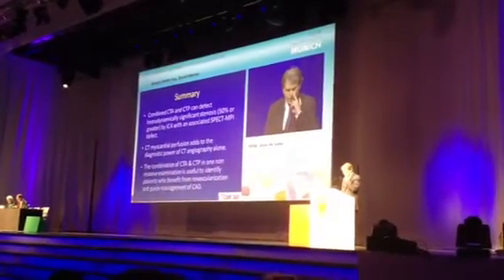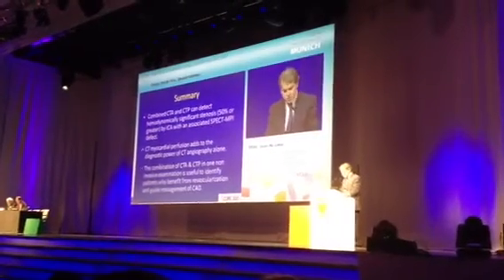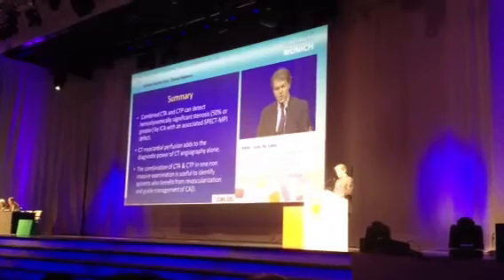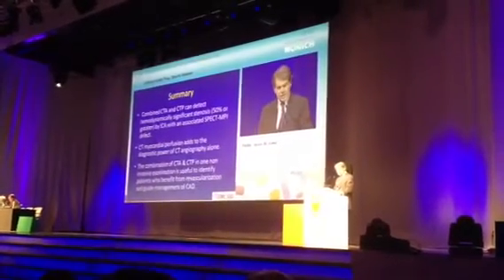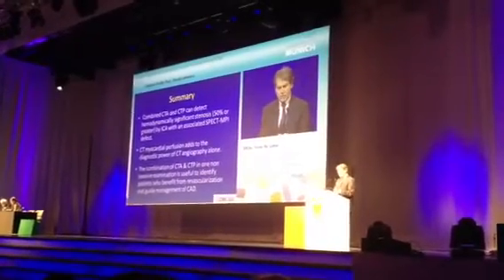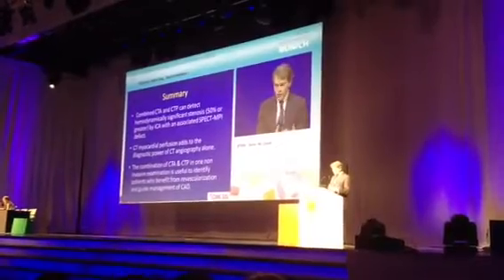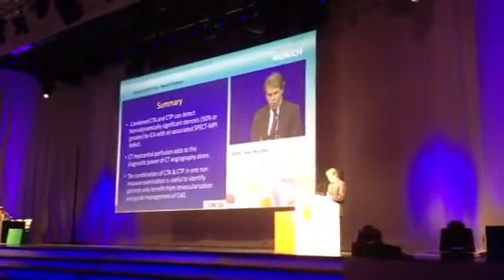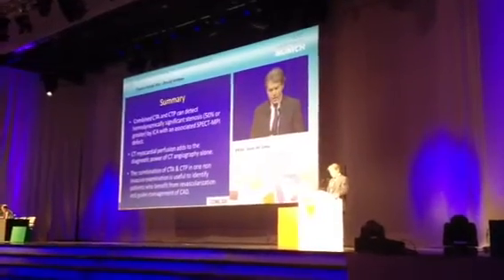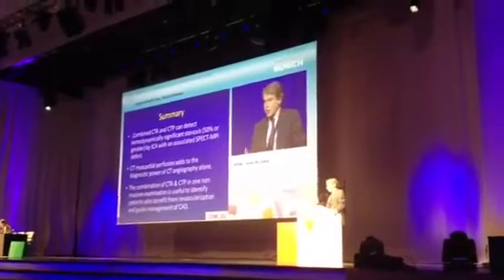So in summary, combined CTA and CTP can detect hemodynamically significant stenosis by invasive coronary angiography with an associated SPECT MPI defect. CT myocardial perfusion adds to the diagnostic power of CT angiography alone, and the combination of CT angiography and CT perfusion in one non-invasive examination is useful to identify patients who benefit from revascularization and therefore to guide management of CAD.